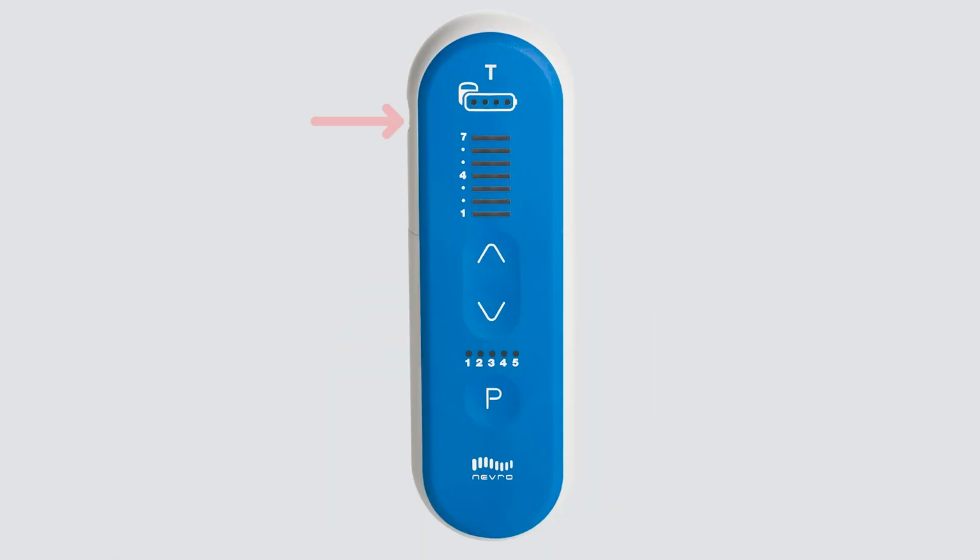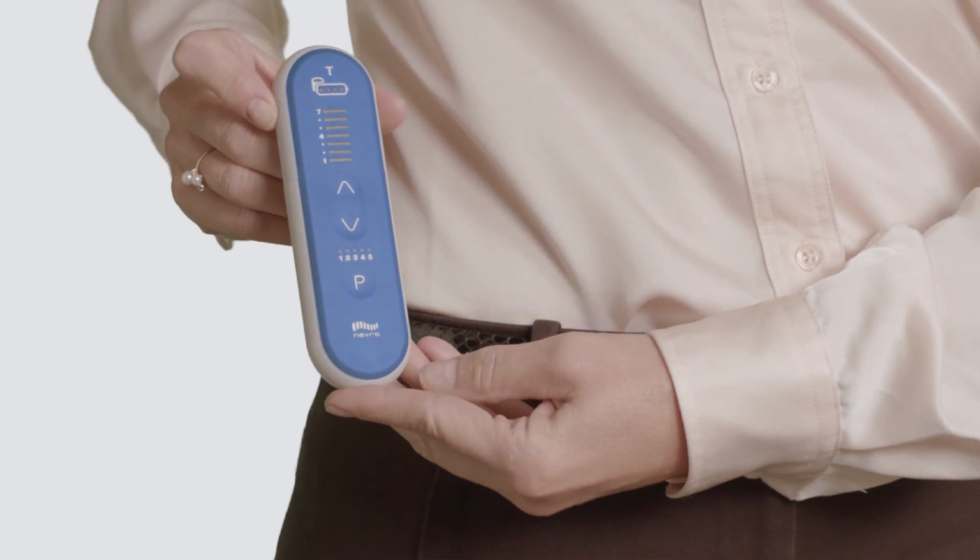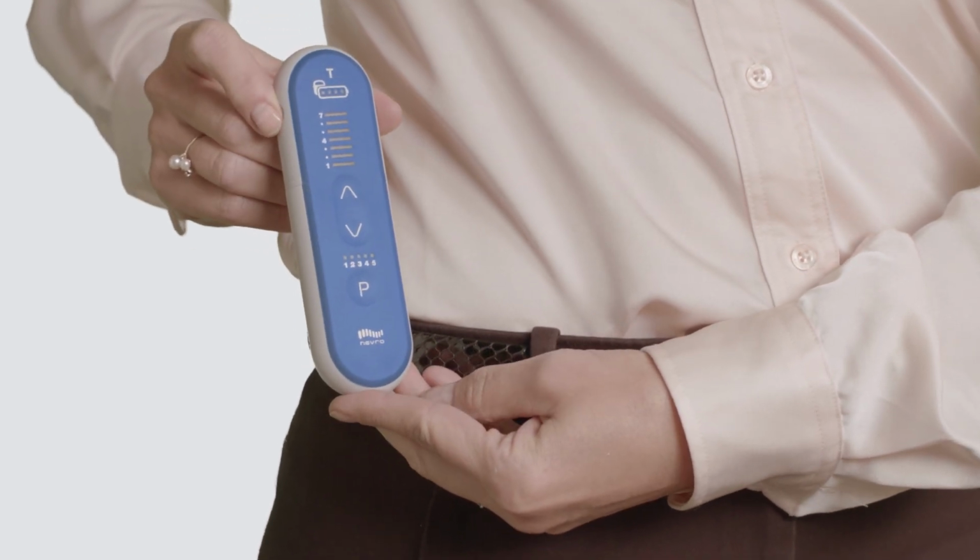To make any adjustments to your stimulation, you must first turn on your remote. Press and hold the remote on-off button for a few seconds until the remote beeps and the lights on the face of the remote stay illuminated. One long beep indicates the remote has connected with your device. 3 beeps will sound and the remote will turn off if connection was unsuccessful. If this happens, try moving the remote closer to your device and press and hold the on-off button again.